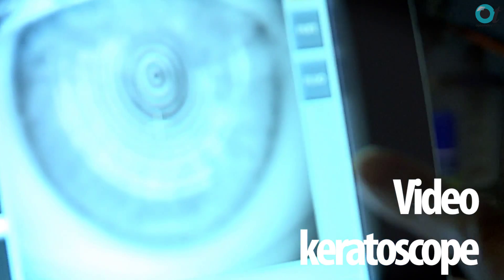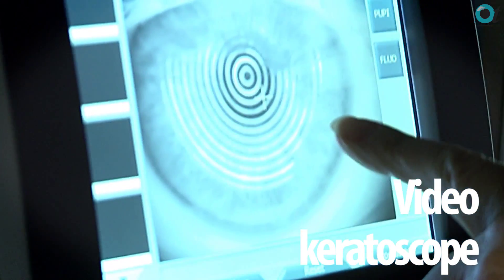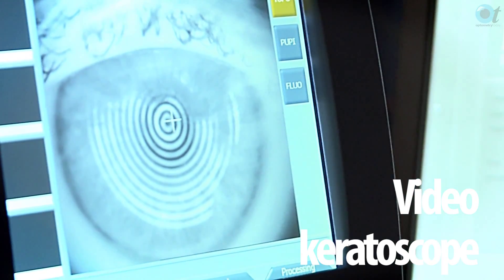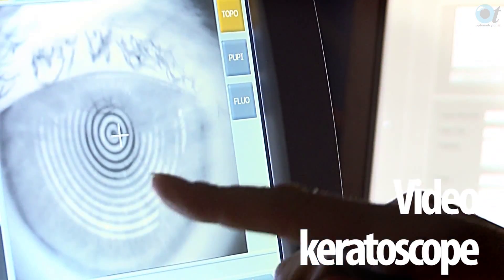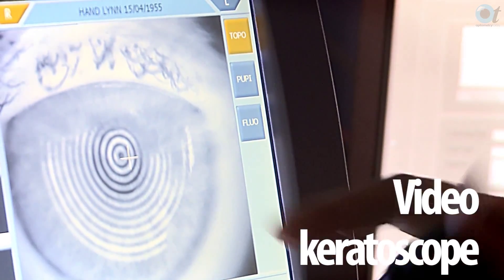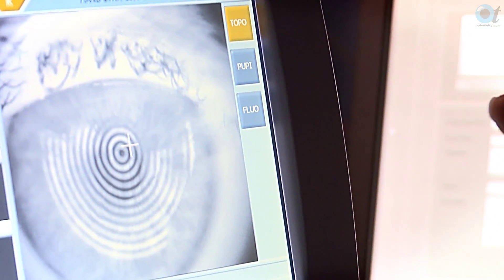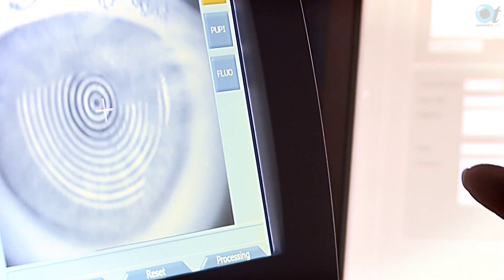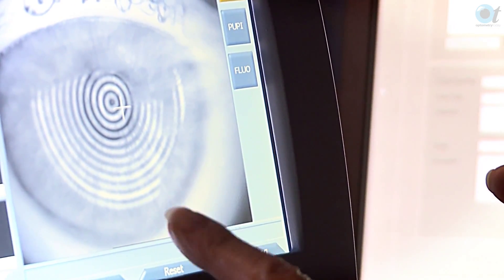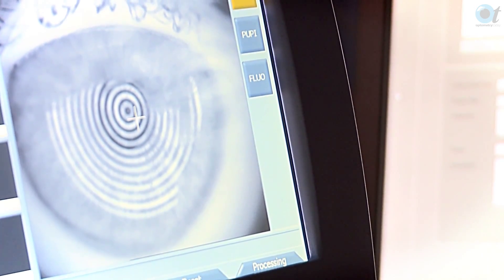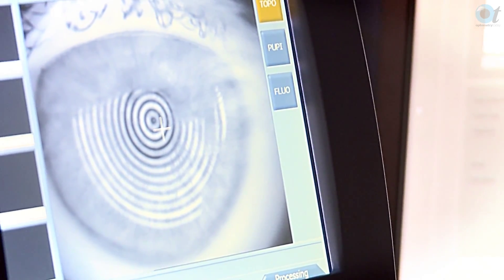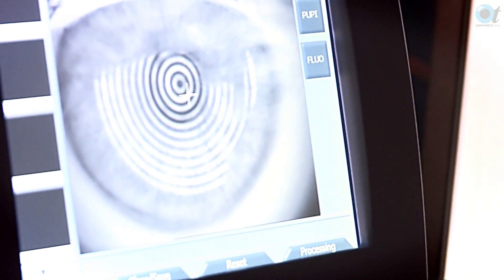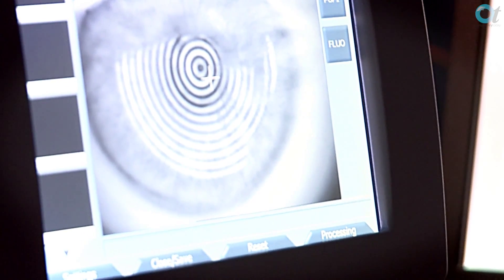On a modern keratoscope you have these mires and you can see them very clearly. When the patient blinks you can see the surface and the oil flowing over the surface of the cornea. All you've got to do is blink once, start the stopwatch, and then when you see those mires distort — now they're going all grainy. Okay, that's 12 seconds.